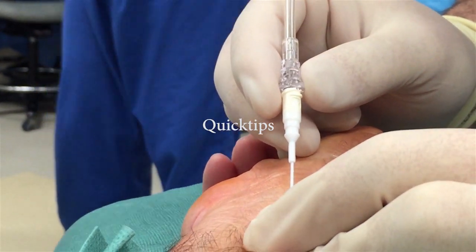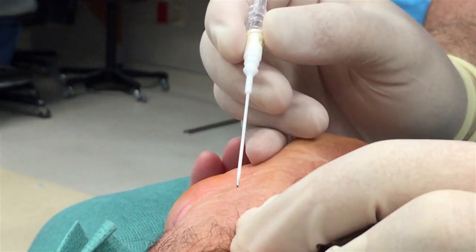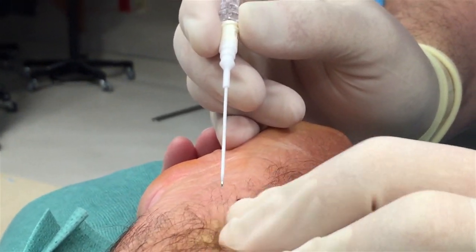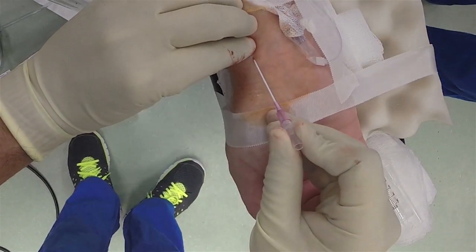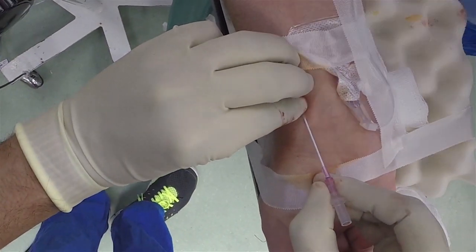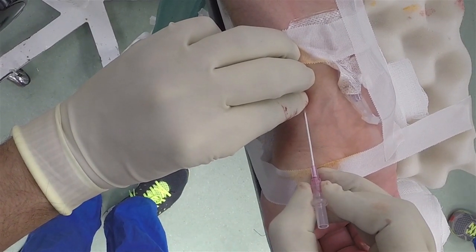Now for some quick tips. You already know the two biggest ones: wait for a rising column of blood, and make sure there's no resistance in the guide wire. Randomly stabbing the forearm is an inefficient way to find the artery. By fully removing the catheter from the skin, each attempt increases the risk of clogging your catheter. Instead, organize your attempts — create a map in your head and slowly shift the catheter a couple of degrees each time. Withdraw the catheter almost to the skin before changing your angle. Your patient will thank you.